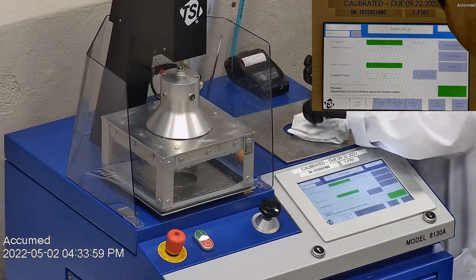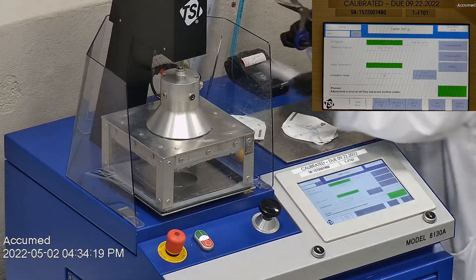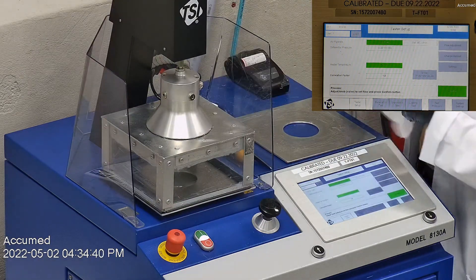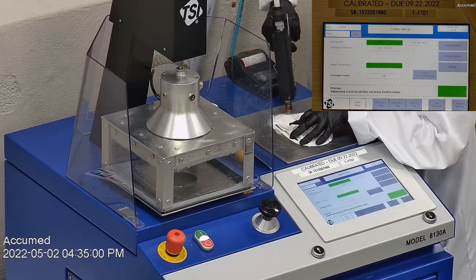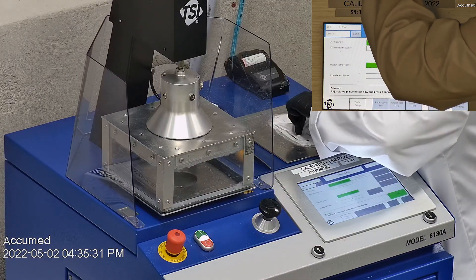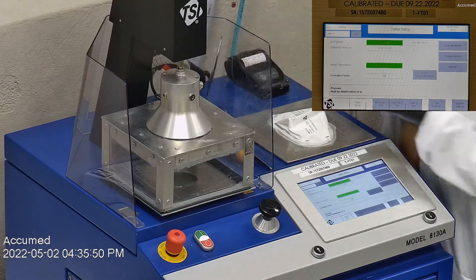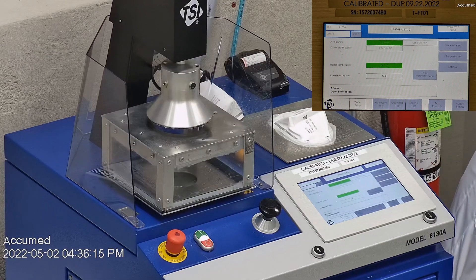This is our TSI machine model 8130A, which is the same filtration testing machine that NIOSH uses to approve N95 respirators. Our procedure is also inspired by NIOSH. We first run the tester setup and remove the headband from the respirator before placing it onto the testing plate to ensure a proper seal. Then we make sure the respirator is completely sealed with hot glue to the testing plate. The testing plate is then attached to the frame and the box is placed under the TSI filter holder for testing.